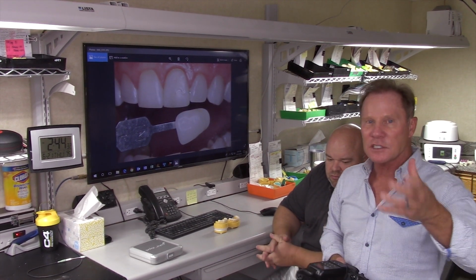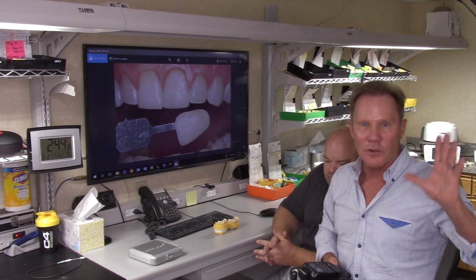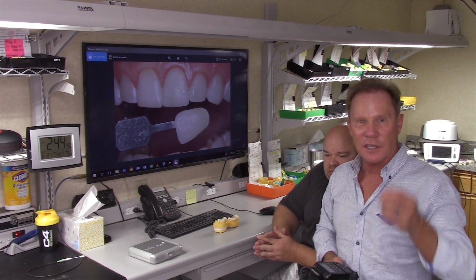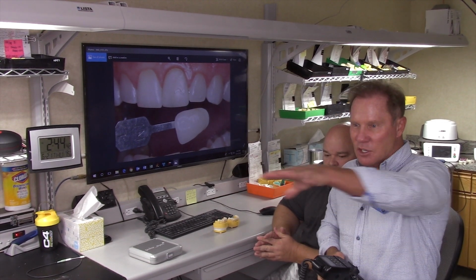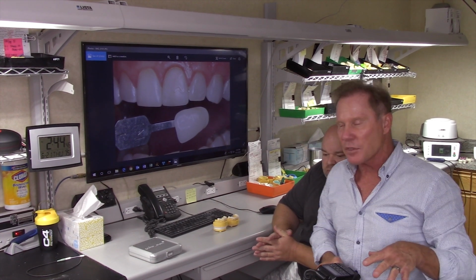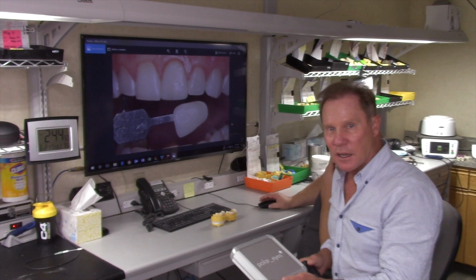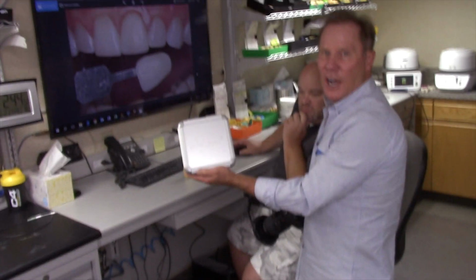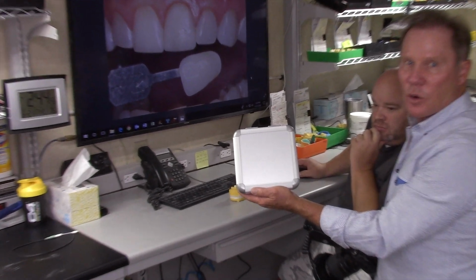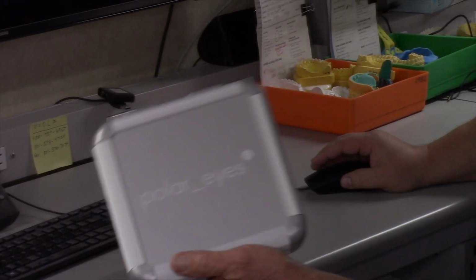Just like polarized sunglasses. You're looking across the ocean or the lake or the snow-covered mountain, and you see those shiny areas. You put polarizing lenses on your sunglasses, and it neutralizes everything and gives you actually a better sense of depth. So the one that I use, you can get from PhotoMed, and it's called Polar Eyes. It's available either for the Nikon or the Canon, and either for the double point or the ring.